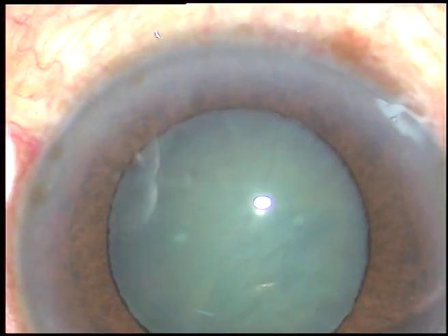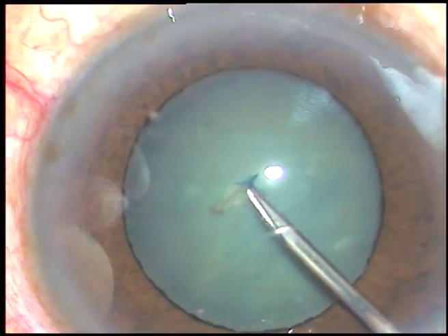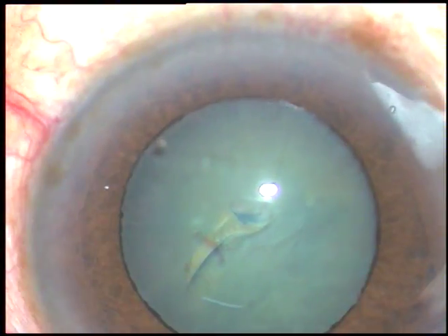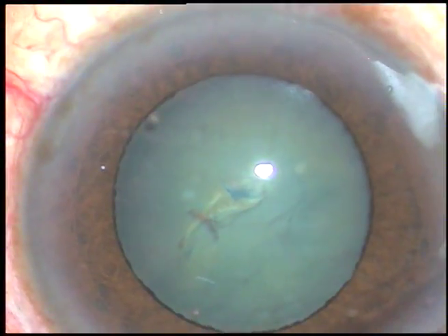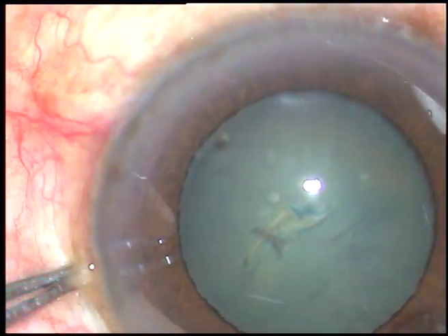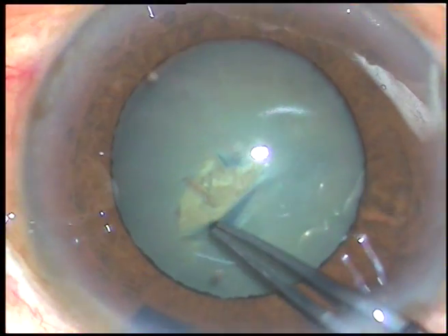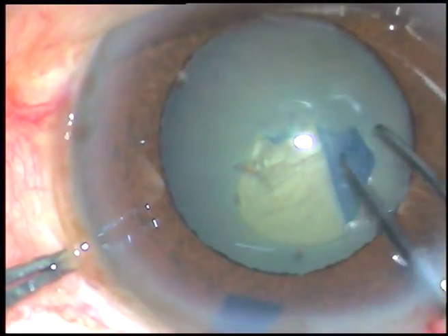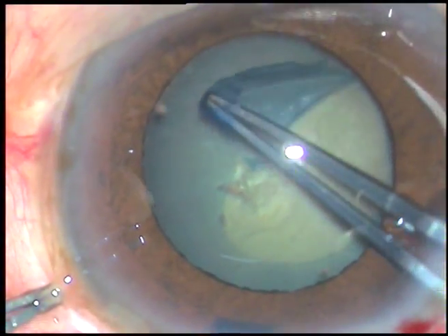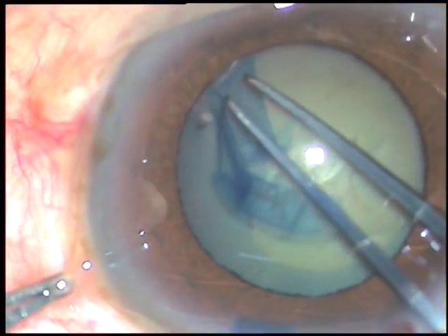A 26-gauge bent needle is taken. The anterior capsule is incised and a capsular tag is raised. I take the utrata forceps, lift the anterior leaf of the main incision, hold this tag, and to make an adequate size rhexis, I go along the border of this poorly dilated pupil.